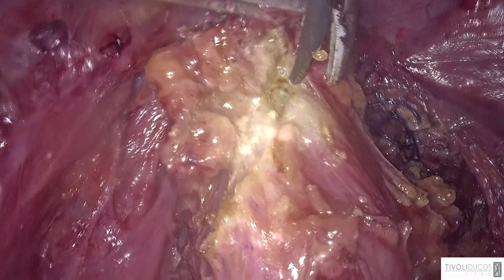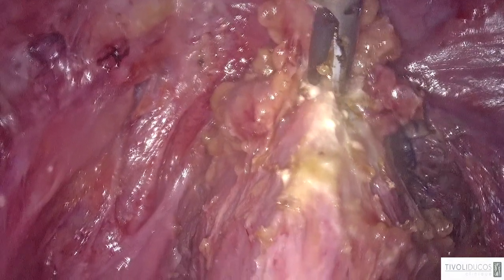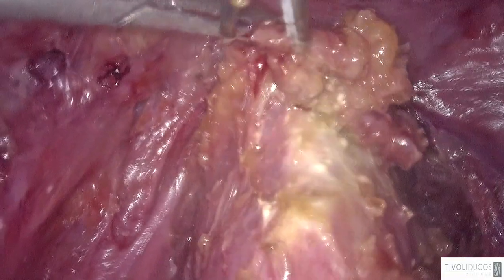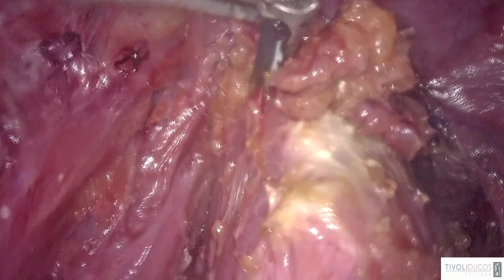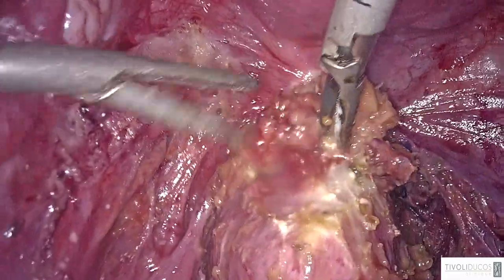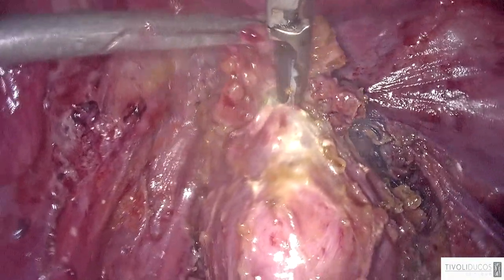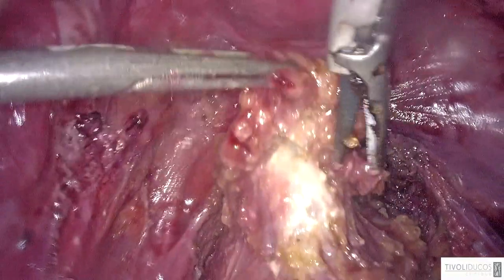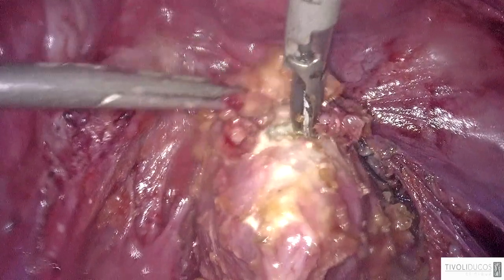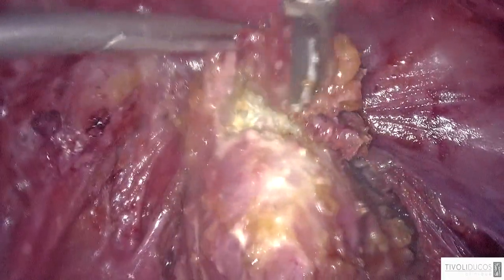And the interest of the disc excision instead of the colorectal resection is obvious for the reduction of functional troubles. So I think that carrying out a disc excision instead of colorectal resection won't actually reduce the risk of fistula, because in both cases you have a suture, and the suture can lead to a fistula. 100 what? No, here 100 a year. The 100 a year disc excision, I said.